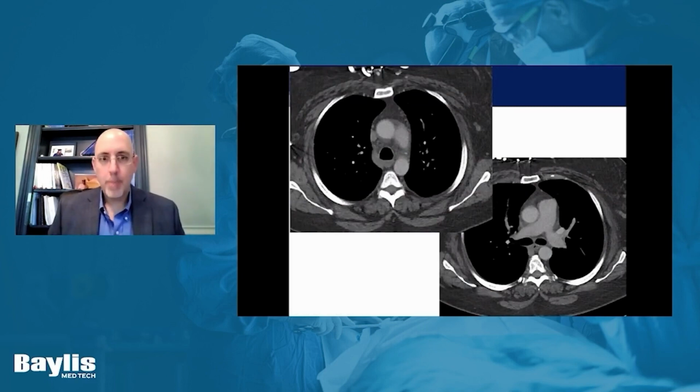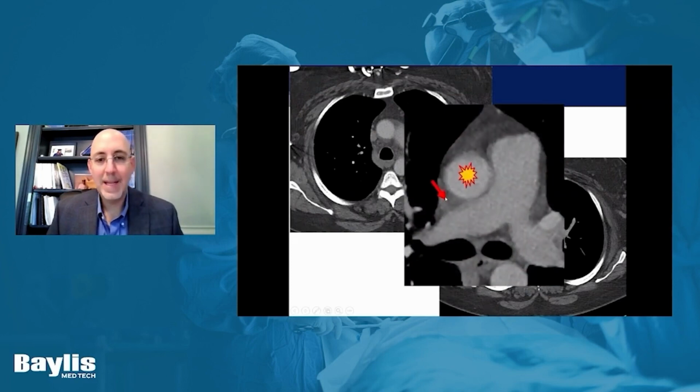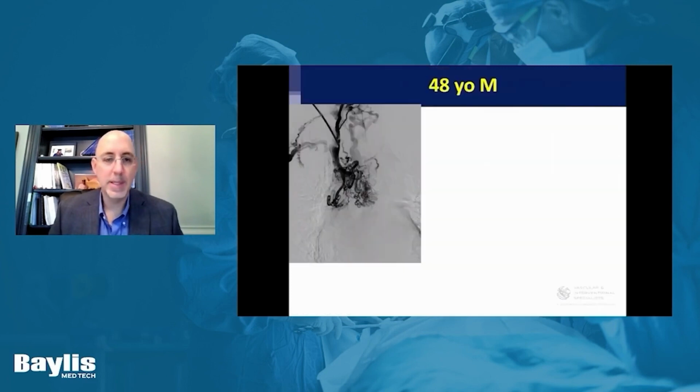Anytime I convert to sharp recanalization, I will tell you a CT is mandatory in my practice. There are a lot of dangers that lurk around here in the chest. Here's a patient with an SVC occlusion, and I will remind you, that is where I need to go, that red arrow. Well, look what's all around it. So your margin for error and your margin for catastrophe is not that high in some of these patients. And so it's really important to have good technique, which we'll discuss.